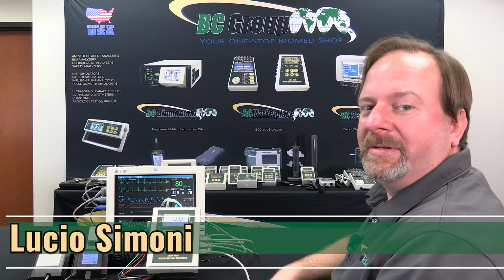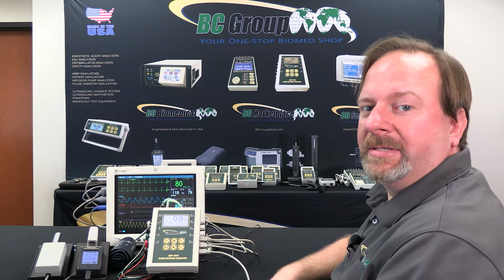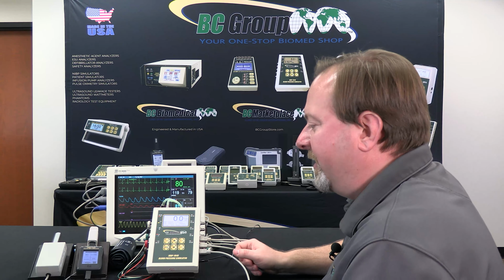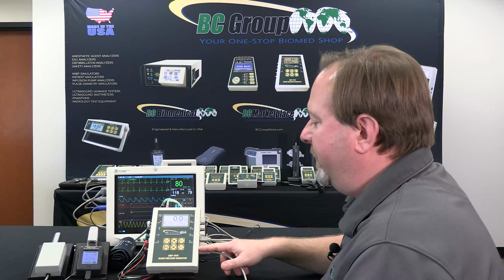I'm the engineering manager for BC Group, and in this video we'll be demonstrating SpO2 simulation using the NIBP-1040 series. In this case, we have our FSX 1101 plugged into the auxiliary port of the NIBP-1040.